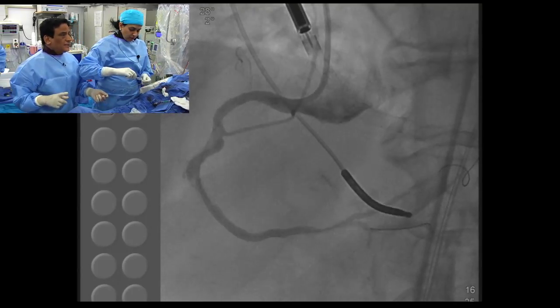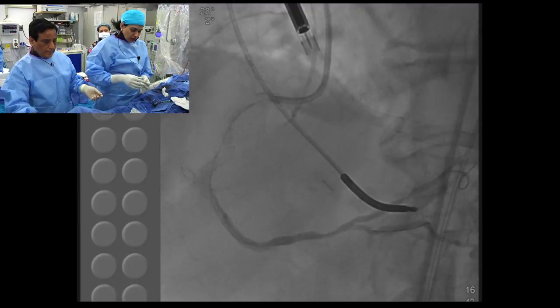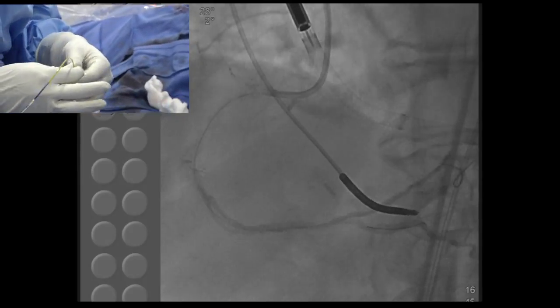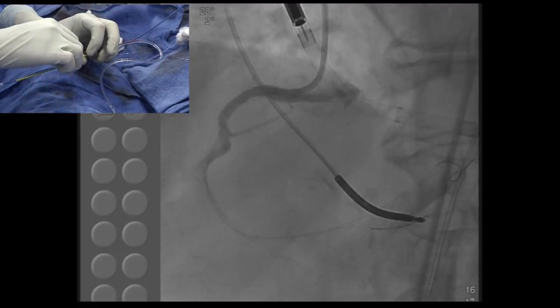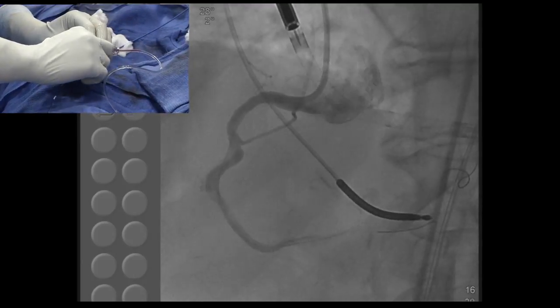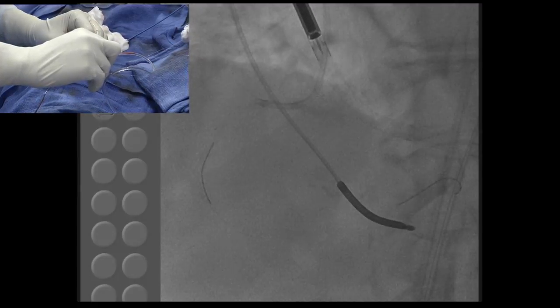Go. Now, what stent are you going to use? We just mentioned that we have not used Impella in cardiogenic shock patients. The Promus Element. Actually, regarding cardiogenic shock patients, the door-to-balloon time is now going down significantly, even with transfer patients. So for this year, 2013, we have not seen a cardiogenic shock patient.